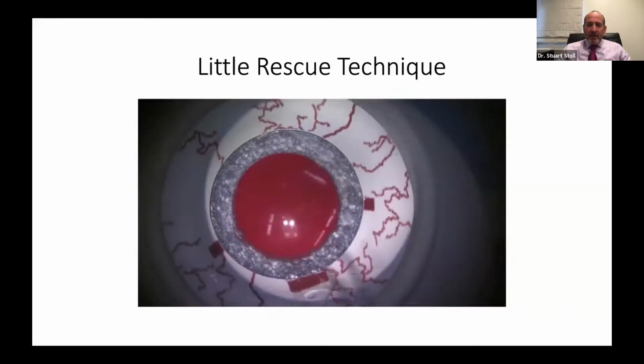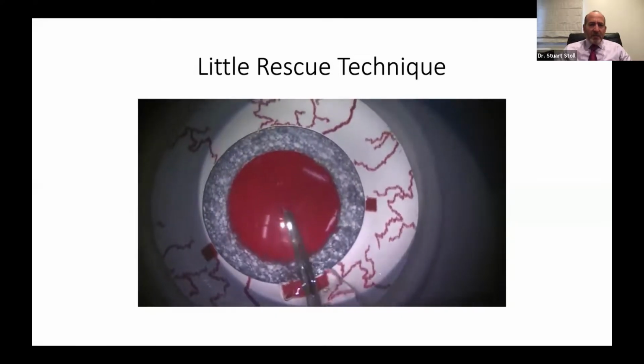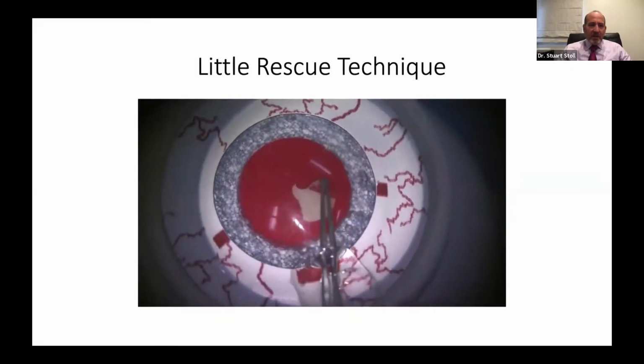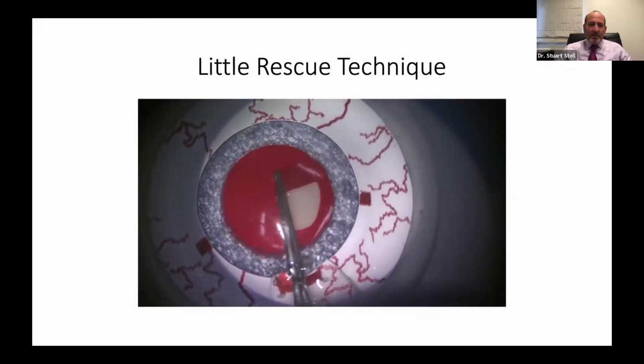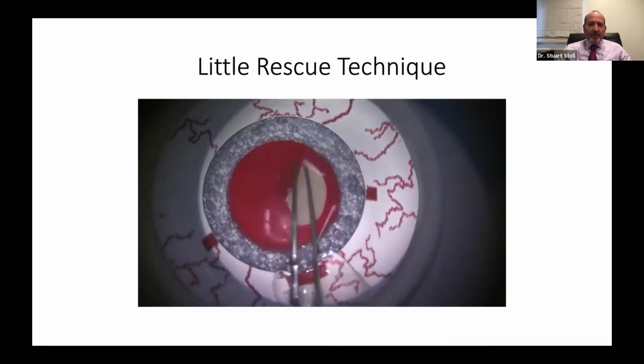Let's look at this again, and here's another example. Again, we're gonna initiate with the cystotome. Actually, no, this time it's with the forceps. So we're gonna initiate with the forceps at 6 o'clock and bring this around. Everything looks like it's going great. We're getting a nice capsulotomy.